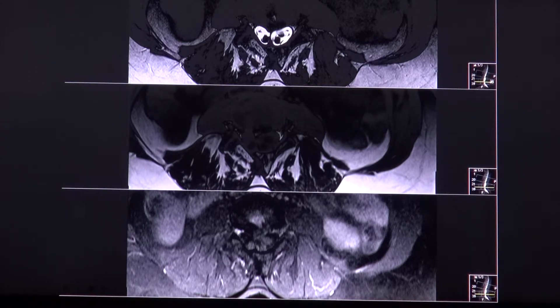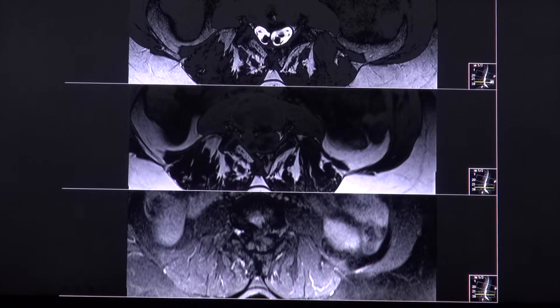This video is about diastomatomyelia. Diastomatomyelia belongs to a spectrum of split notochord syndromes.